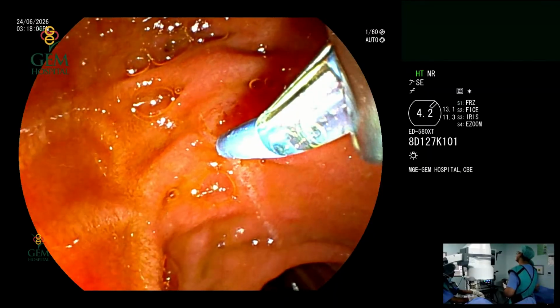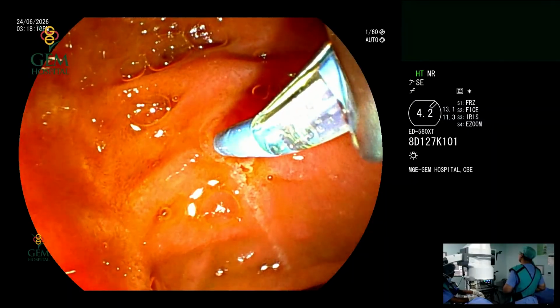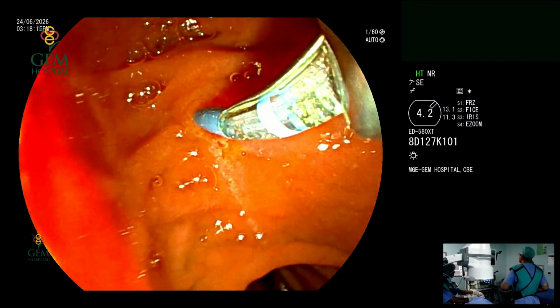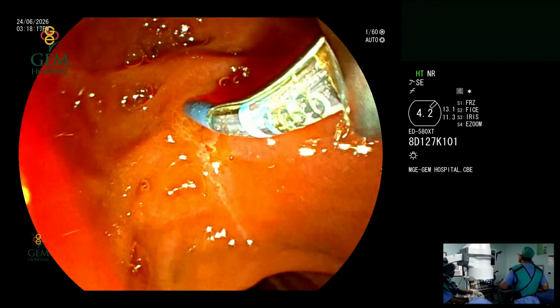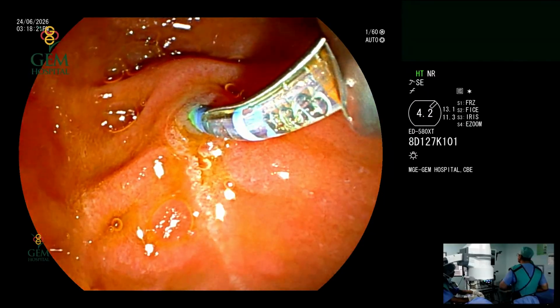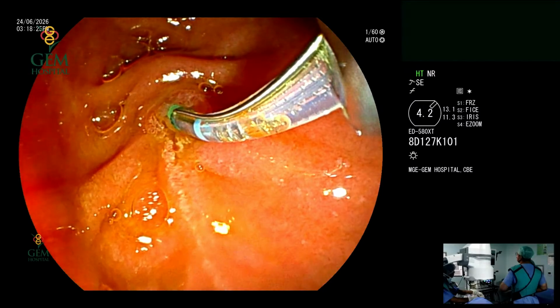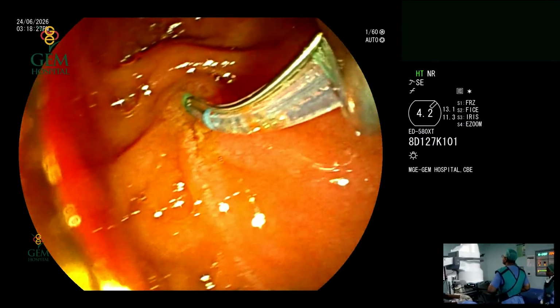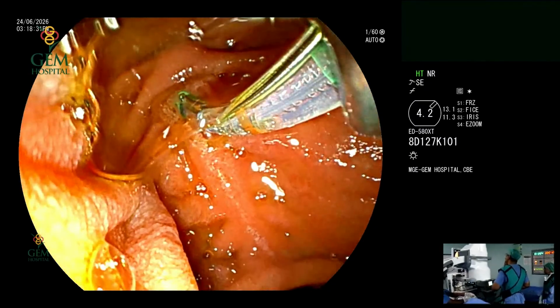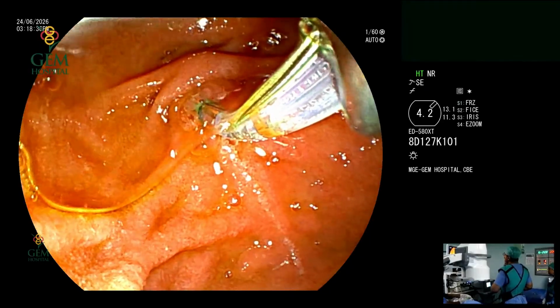So we are still maintaining an upper quadrant with the right side skew of the papilla. We have made sure the sphincterotome is neither too away nor too close. And we are trying to cannulate in such a way that the upper 11 o'clock of the papilla is touched, as you can see here, right? And when you cannulate here, make sure too much pressure is not put. If you do put too much pressure, there is a very good chance that it might take a straighter course and go into the PD, which is not desirable for most of our cases. And don't push the sphincterotome.